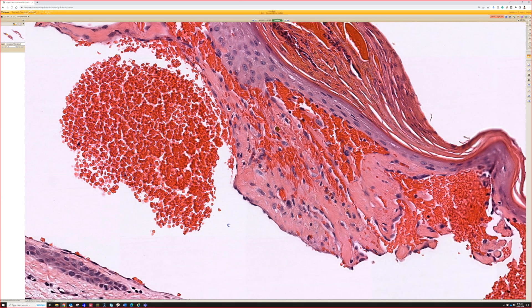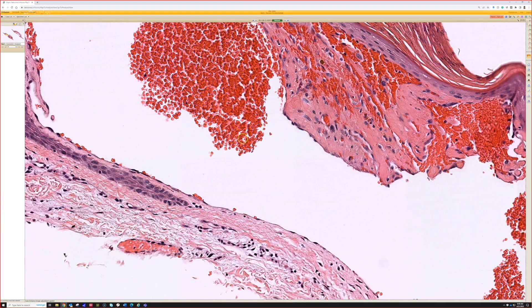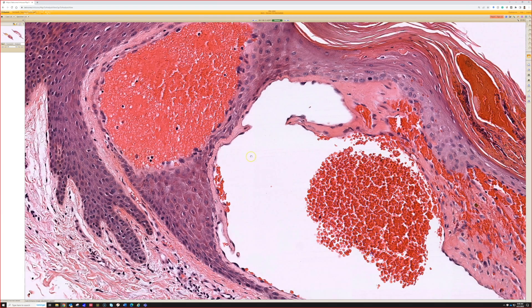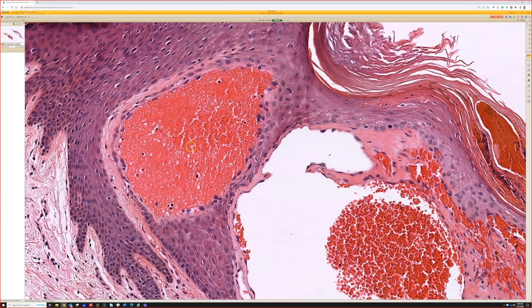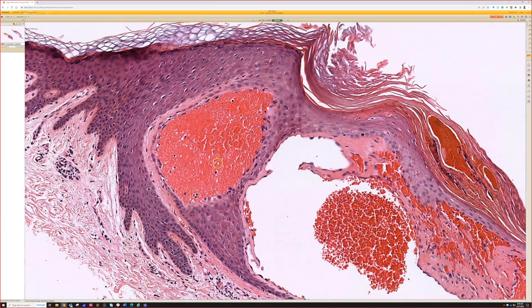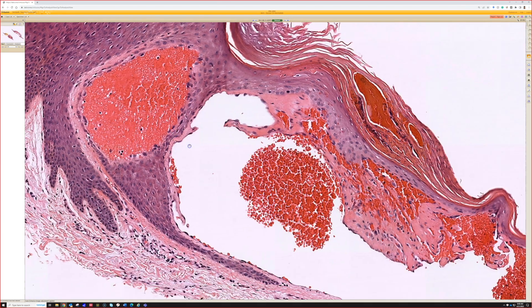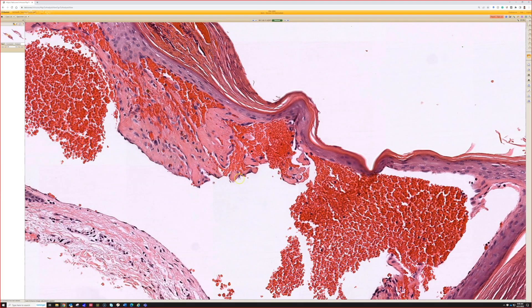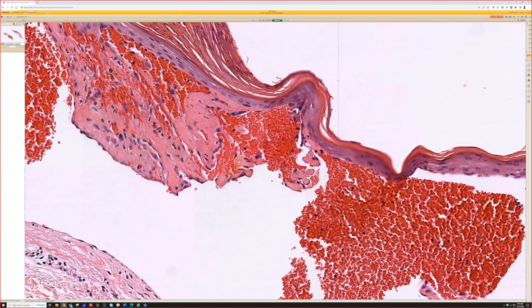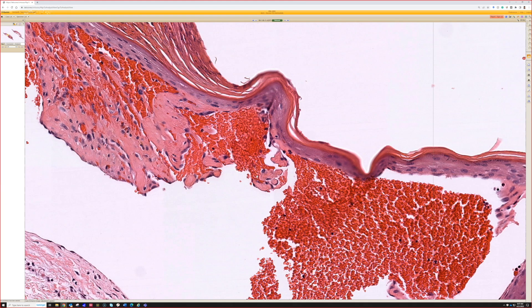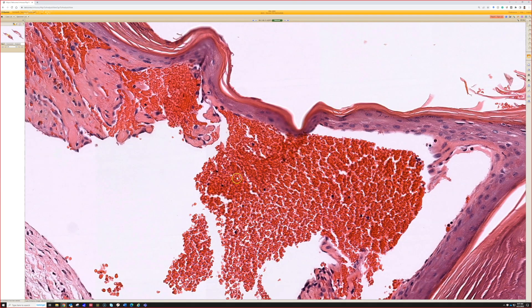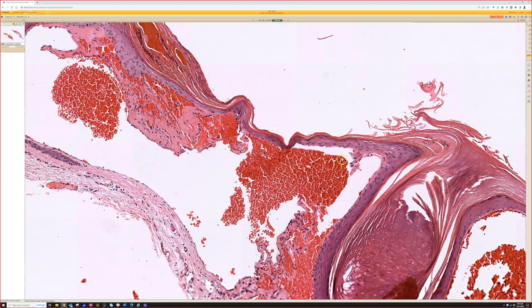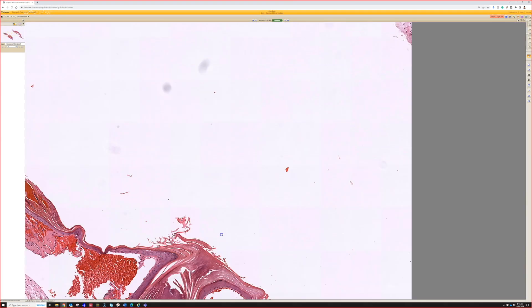So in any case, that's what you've got. These vessels that are floating, it looks like they're floating in the epidermis because the epidermis is wrapping around them. Oftentimes you get thrombus in here and look, this thrombus is starting to organize and make some papillary endothelial hyperplasia tumor type of effect. There was a little more of it up in this top piece actually.